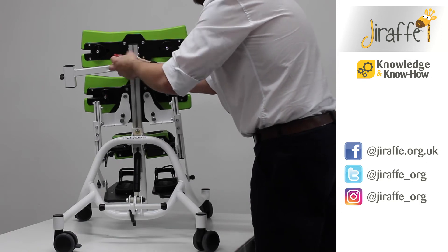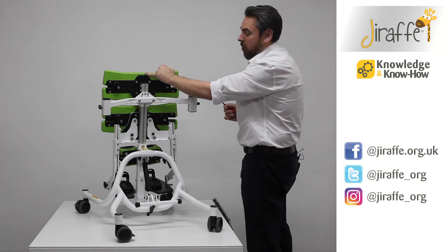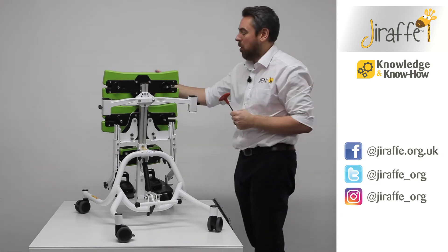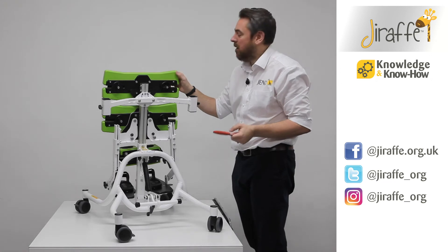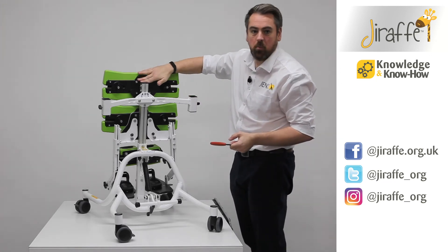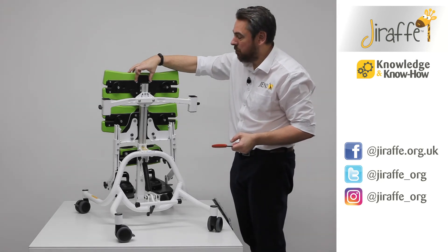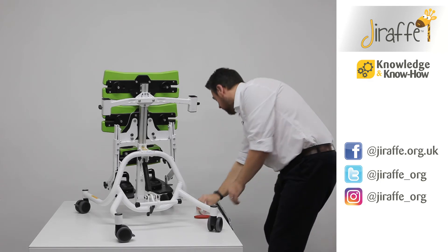One other thing we can achieve when using the product in prone is we can bring the chest board down lower if we wish to, which is the bolt on the front as seen in our adjustment videos. That allows us to bring the top of the pad down flush with the central post. We can't do this in supine because we need to mount the head support bracket.